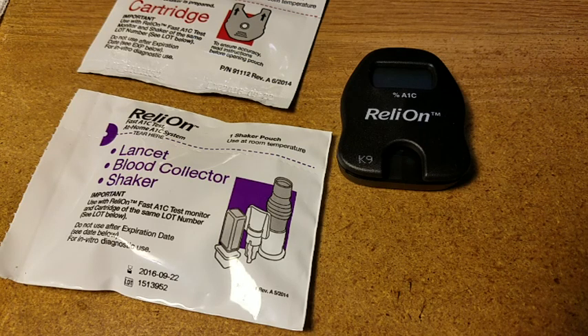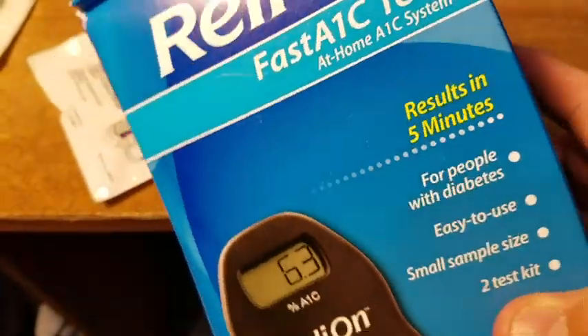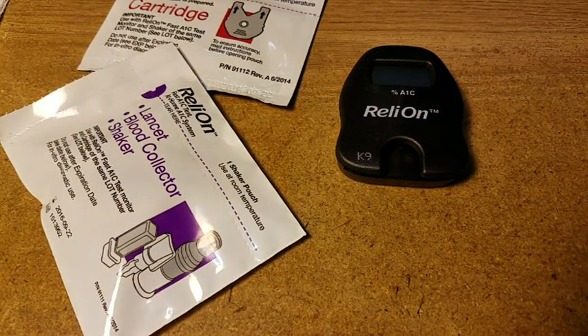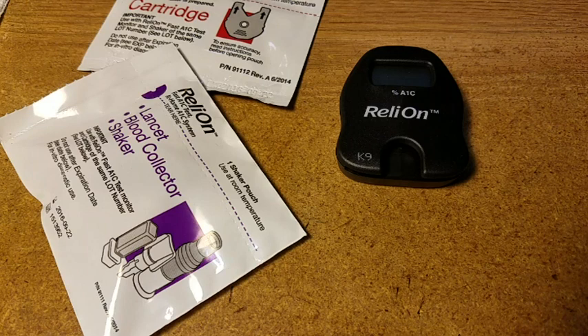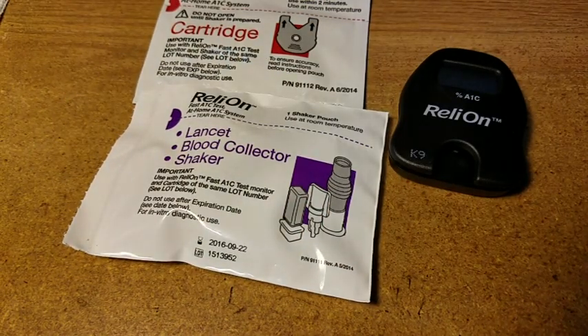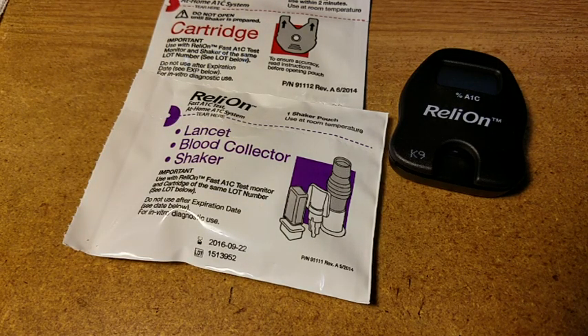Good morning everybody, this is NCP. I just got back from the doctor and had a bunch of blood work done, and I have this ReliOn A1C home test. I want to test its accuracy versus the lab results from the doctor. I've had this thing for a while and just been lazy and haven't done it. We'll also do a scan of my sugar level in a minute — this is all on the keto diet.